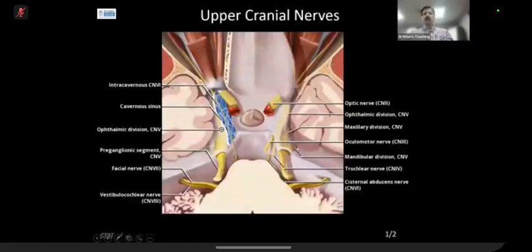And I'm going to show you a case today of perineural spread. So this is the anatomy. So I repeat, fifth nerve, which goes into the Meckel's cave, two branches, V1 and V2 go into the cavernous sinus. V3 goes through the foramen ovale into the masticator space. Now, sixth nerve passes through the sphenoid bone and goes into the cavernous sinus, and of course goes into the orbit.